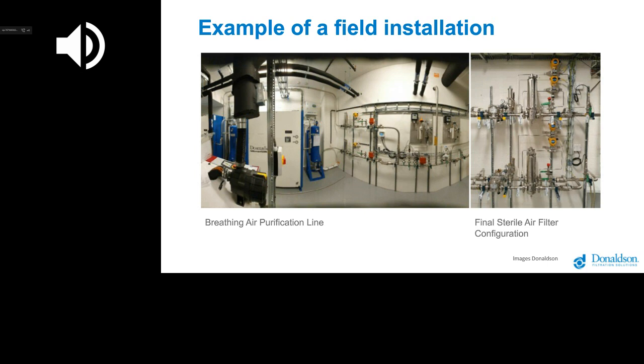In addition to this, everything is designed in accordance with ISO and the EU Pharmacopoeia. The air is supplied by a lubricated air compressor, so there is oil being added to the compressor. So on this occasion, this is a very good reason to add the additional activated carbon tower that you can see to the right of the white cabinet in the picture.